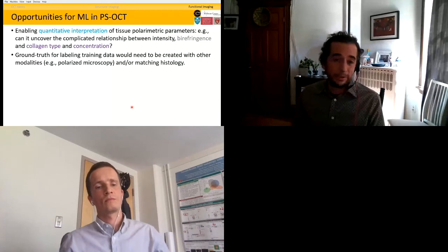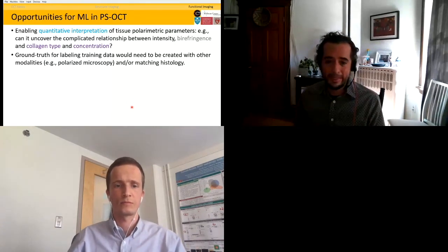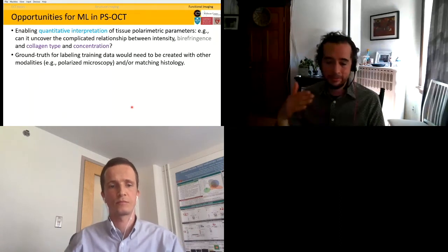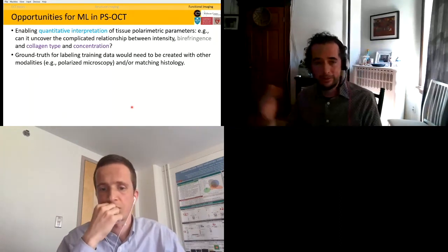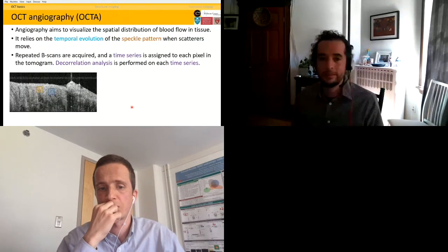However, of course, this requires this complicated creation of training data, labeling using other modalities, and this is definitely a challenge because we require matching histology, which is definitely not easy.